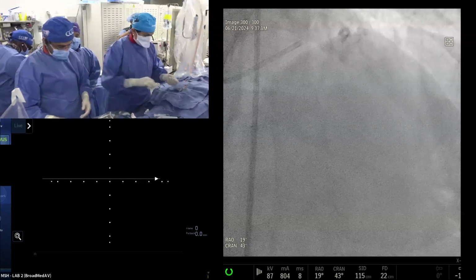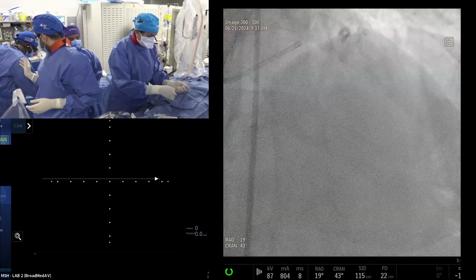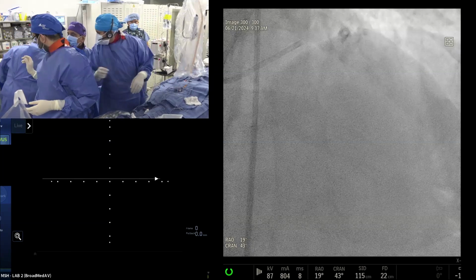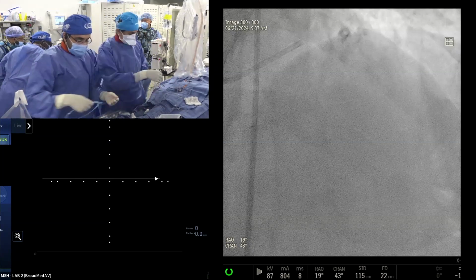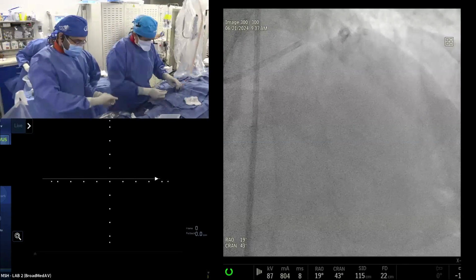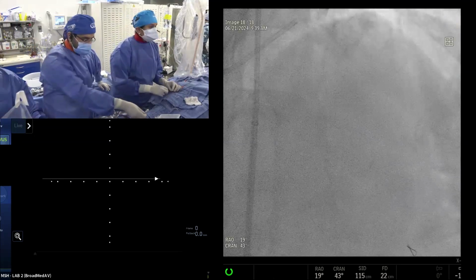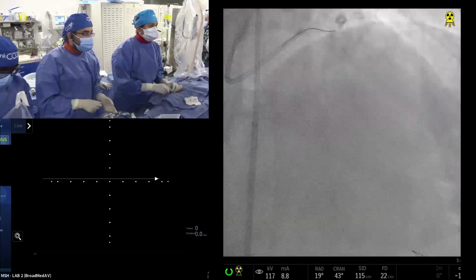But at the same time, we're trying to test this strategy. Now this one we can call a peri-stent, it's like a stent, in-segment. Not necessarily in-stent lesion, but it probably would be neoatherosclerosis if in the segment, because the stent was done, Promus, in 2011, so 13 years ago. And both the diagonal stent as well as the LAD stents were done so long ago. And now the patient has come back. I think it may be more of an incidental finding. And so this is what we are going to do in this case.